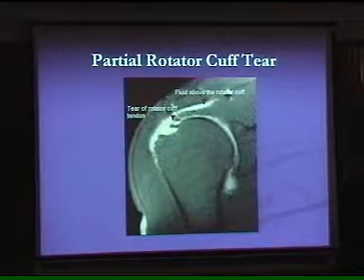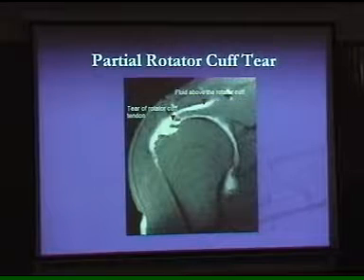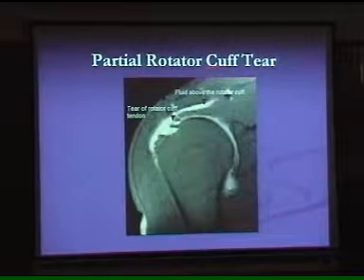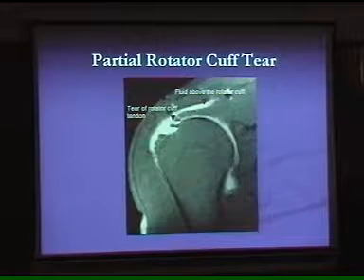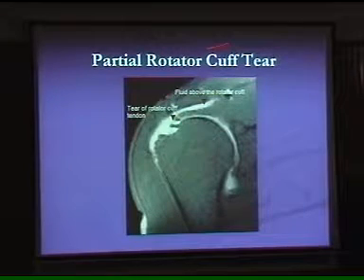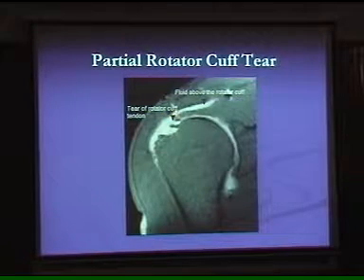Sometimes with rotator cuff tears these days, with high resolution, something like 15 megahertz or 14 megahertz, we are diagnosing these tears, especially in sportsmen and young people, and even old ladies when the hands become restricted. To appreciate this, initially we used to do the X-ray, with a minor linear density at the level of the supraspinatus muscle. But these days you can appreciate this image on T2 weighted images.